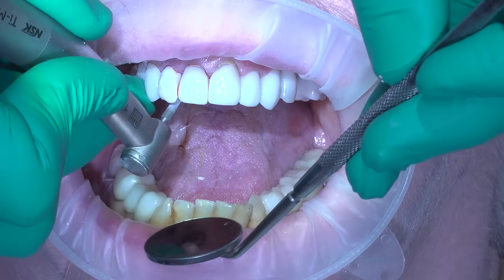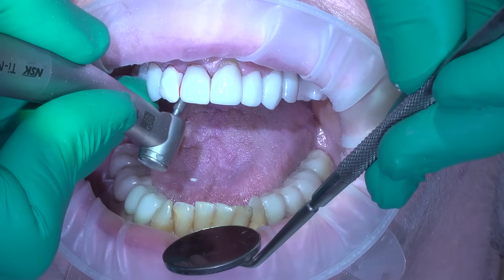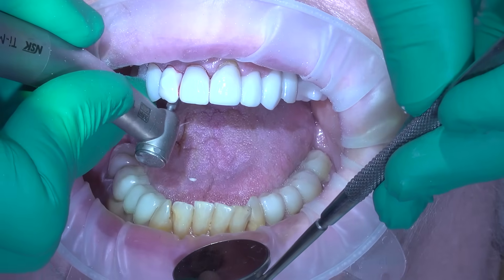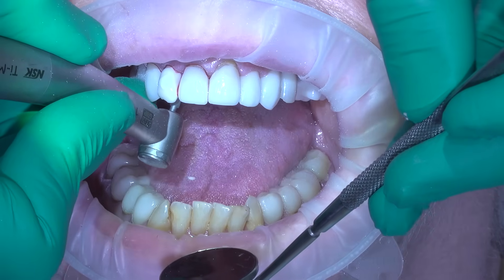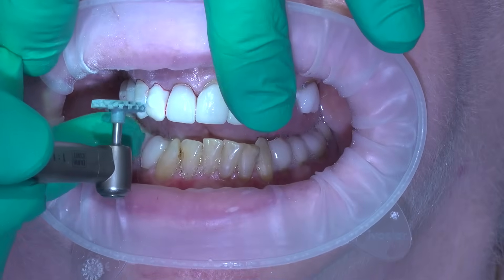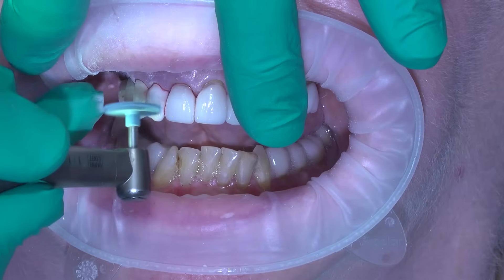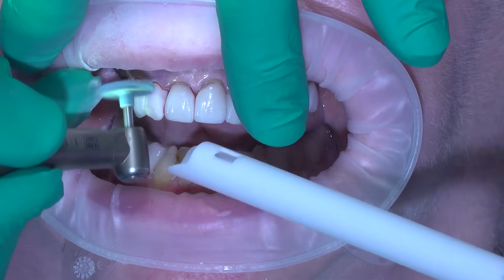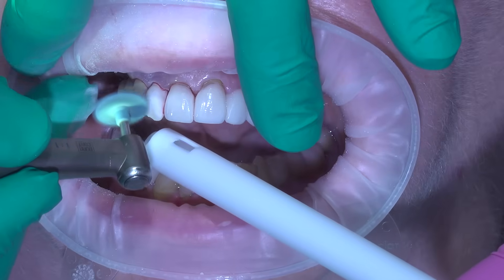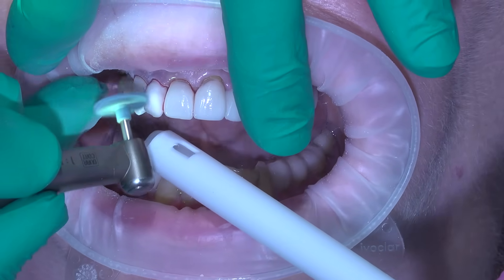The facial wing is already off and we'll remove the lingual one. At this point we're about six minutes into the case — tooth's been removed, implant's been placed, bone graft's been placed, provisional's been placed. Now I start futzing. Depending on your disposition, you can futz for a long time. If you've placed the implant in four minutes, you've got some time to have some fun and make this look as good as you want. I don't put a whole lot of effort into it because it's a provisional.